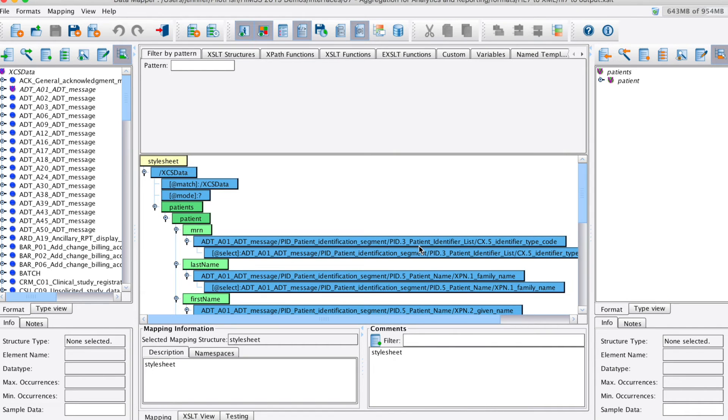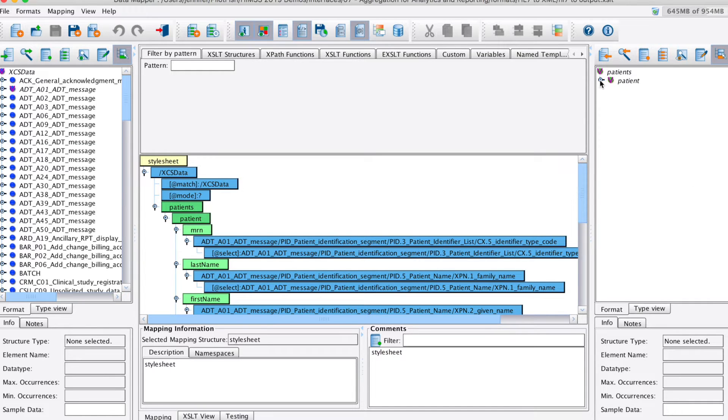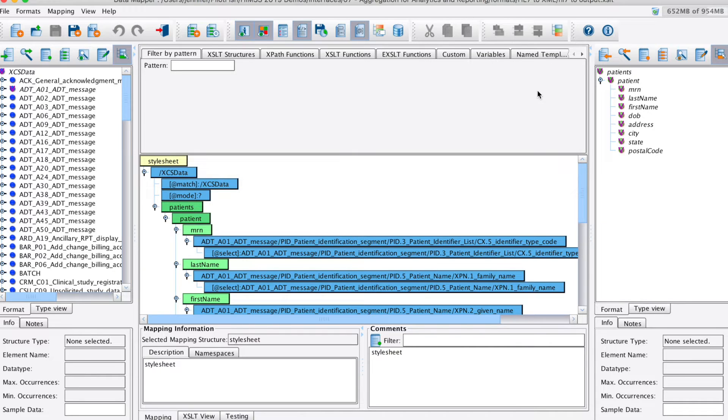Data transformations in the EI console are handled using PilotFuse's data mapper. All of your logical mapping is done here between your source format, in this case our HL7 data, represented as a tree to the left, and our target format. In this case, a custom XML representation of some of the patient data we wanted to retain in our database.